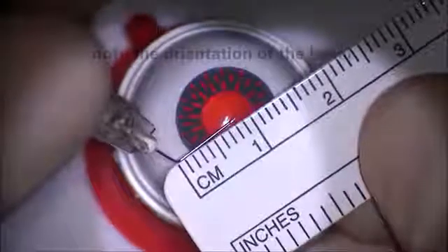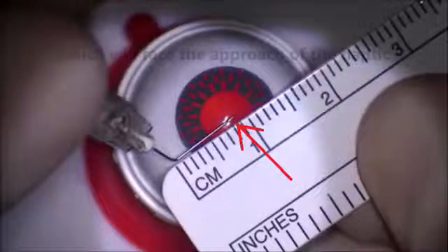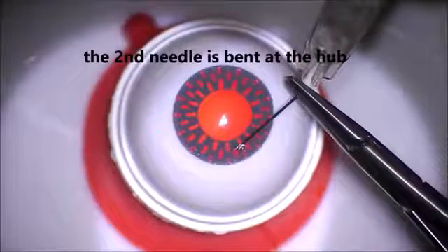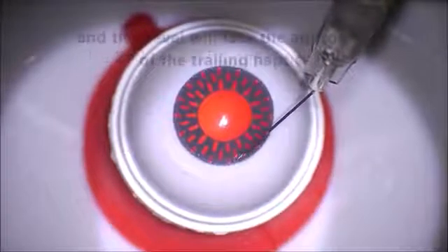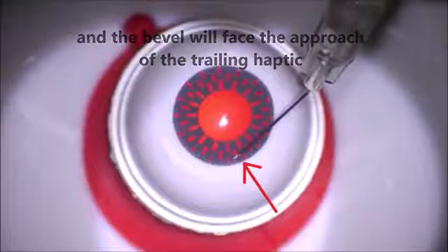When you have the actual syringe facing up and down, the bevel will be facing the main incision, which is facing towards you — because the IOL and the haptic will be coming through the main incision. You want to make sure the bevel is facing the incision towards you. For the first needle, mount it on a syringe for better control. For the second needle, bent at the hub, the bevel should also approach the trailing haptic, facing towards you and the main incision. Whenever you bend the needle, make sure the bevel faces the approach of the haptic.